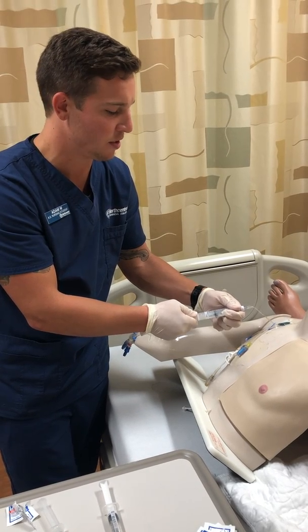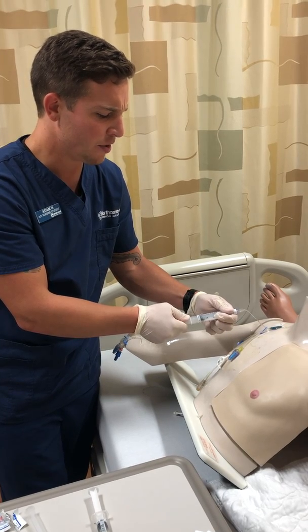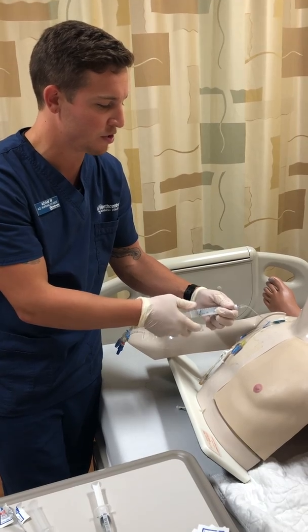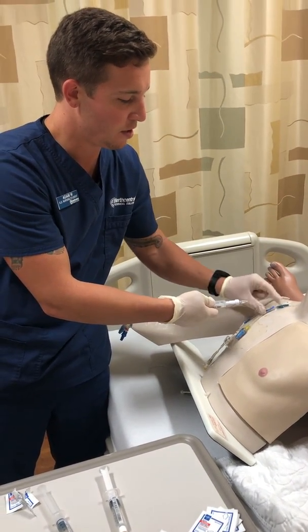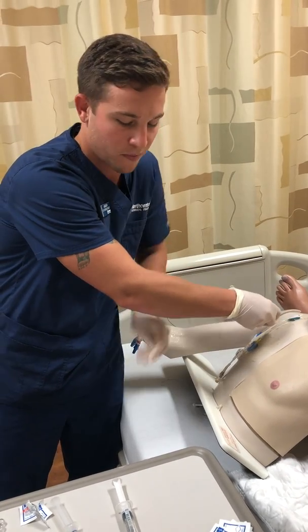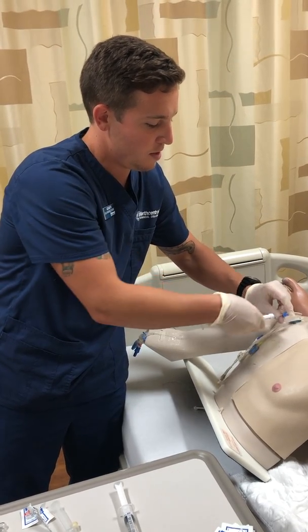A lifespan consideration would be if you're on a peds patient, you only take what you need, because they only have so much blood, so you can cause complications by taking out too much blood, especially when it's not needed. Okay, so now that we have what we need, we'll reclamp again and take this off.